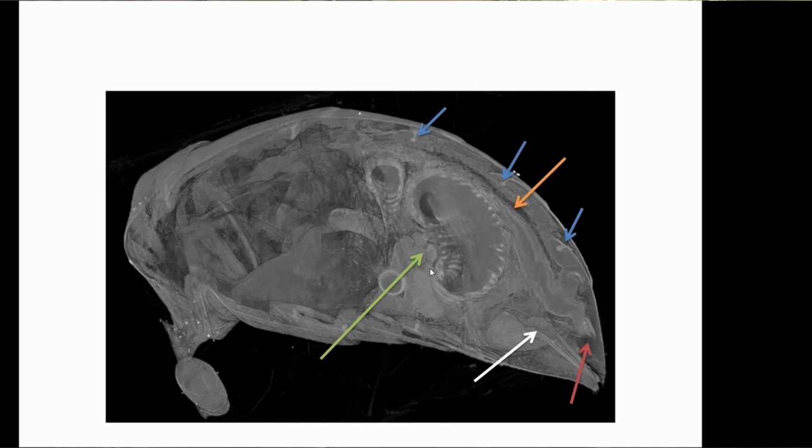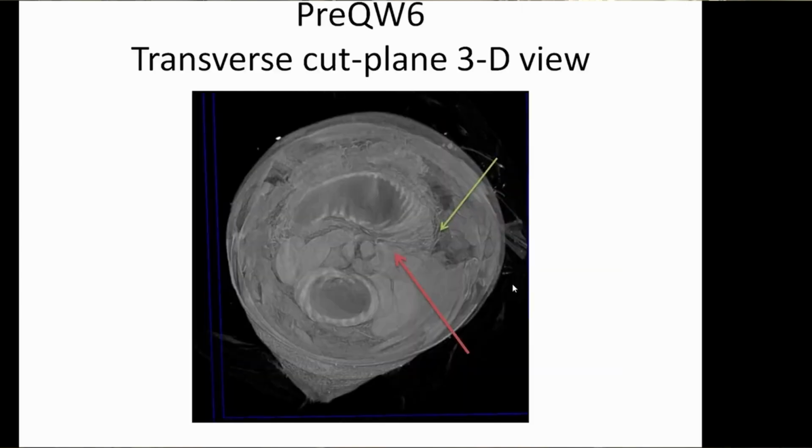So we're seeing eggs, we're seeing dilated bowel, and we are seeing Malpighian tubules. On a transverse cut, again, we're seeing the eggs. I think rather better, we're seeing these little wiggly chaps, the Malpighian tubules.